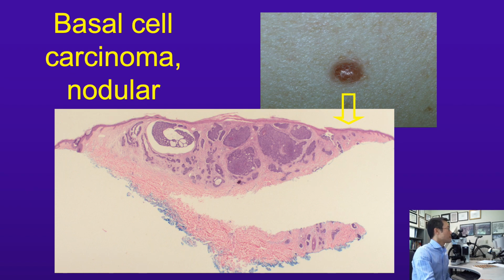As you might expect, nodular basal cell carcinoma is composed of more or less nodular aggregates of tumor cells. And again, it's diagnostic from scanning magnification alone. We see more or less rounded aggregates of purple or basaloid tumor cells. Many of these tumor aggregates don't have clefts around them, but usually if you have enough of a sample, there will be a giveaway somewhere. So there's a little bit of cleft right here, and then, wow, massive cleft. The giveaway cleft, if you will.